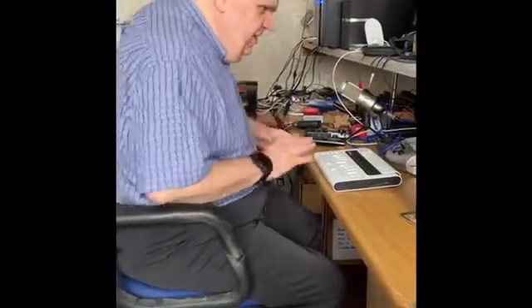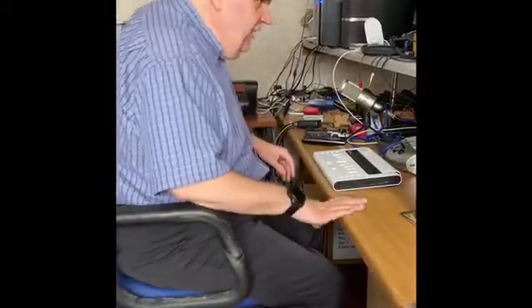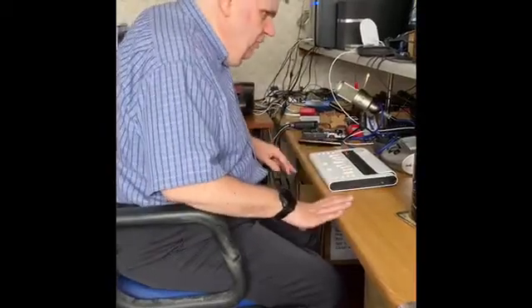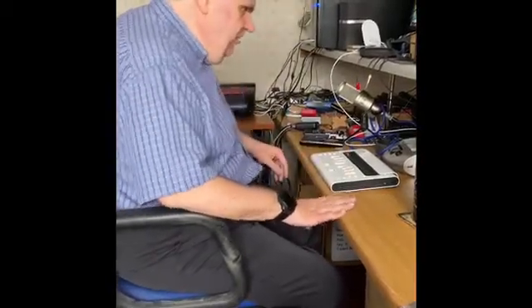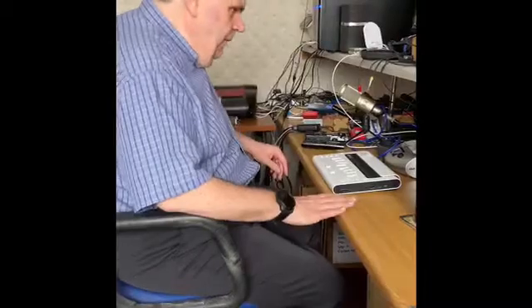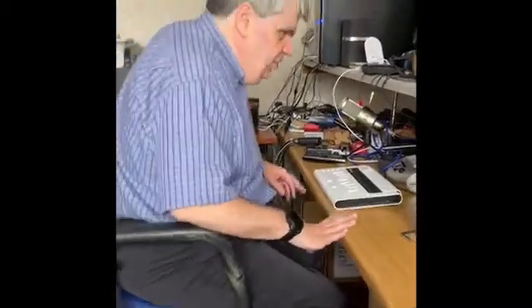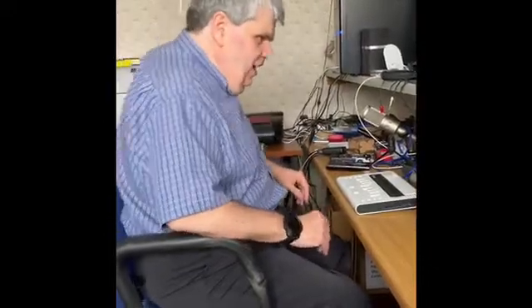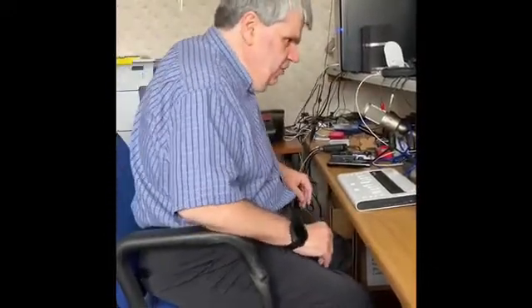Now, I said this is based on Windows 10. I'm in its own note-taking environment at the moment. It can do grade 1, grade 2, music and maths braille. If you do music, you can actually type music into it and have it play it back to you, so that you can make sure the notes are right and you've got the right note durations and lengths and things like that, which I think is a first in the note taker world.